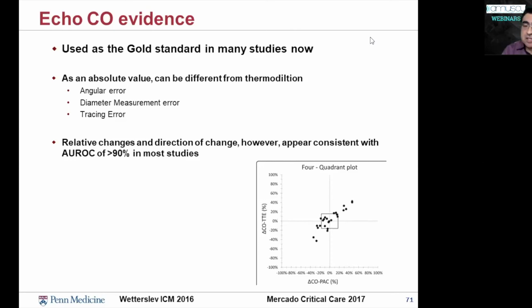But if the patient doesn't have B lines, we must think of another kind of shock, or what's your opinion about this, Cameron? Yeah, this is a very good question. We all know that no one has one form of shock. Everyone has overlapping forms, a little bit of cardiogenic, a little bit of distributive. And so for a patient who you see impaired cardiac function, but you still see A lines, the only way that's consistent is if they are also hypovolemic.